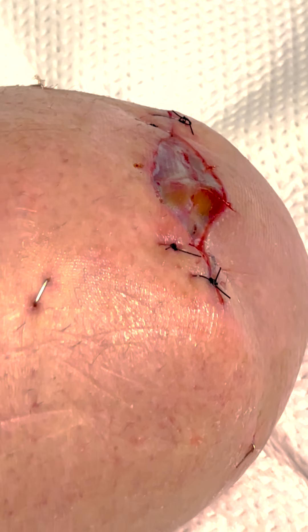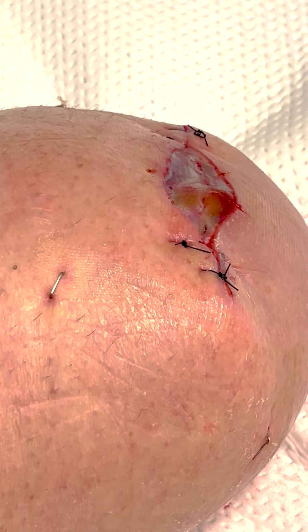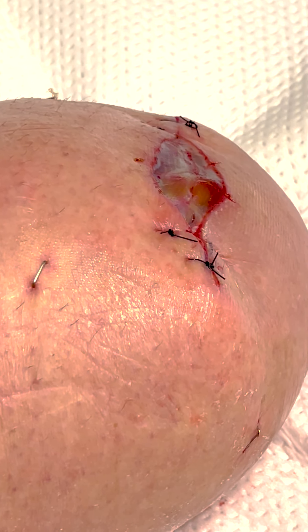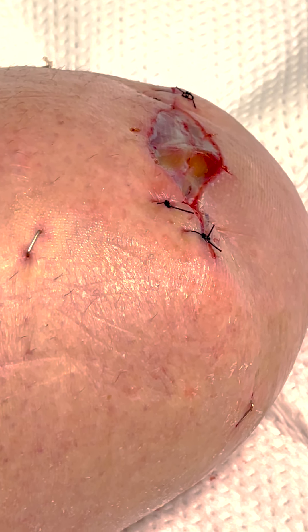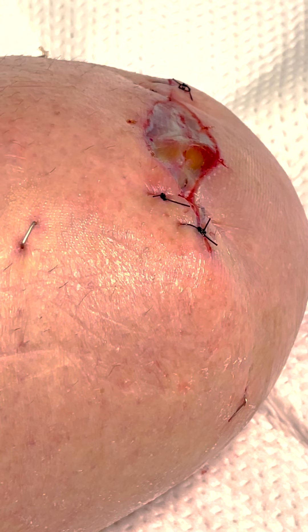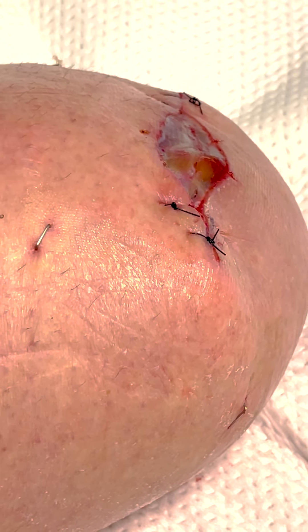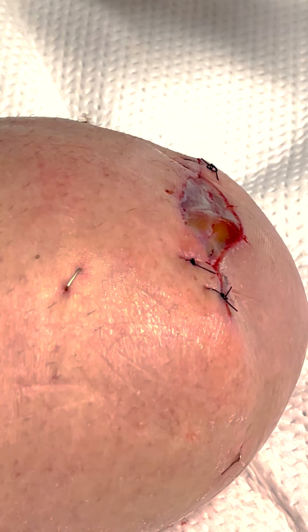Right now the wound care nurse is going to take the staples out, so we'll get a video of her taking the staples out so you can see what that looks like. Then the next thing we'll do is have the wound vac put back on — I've had the wound vac on since Thursday. Let's go ahead and cut some staples out. Why don't we start with that one right there? Yeah, perfect.